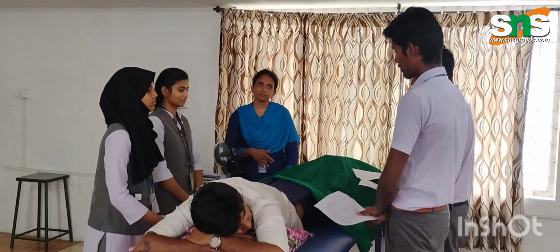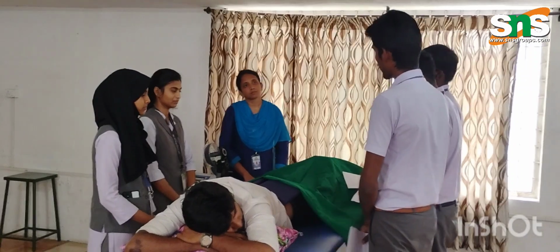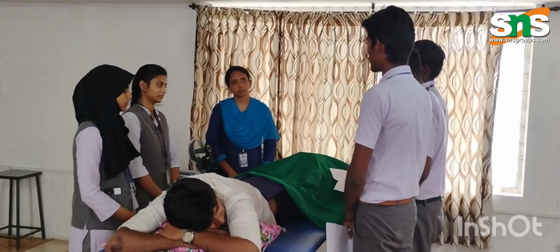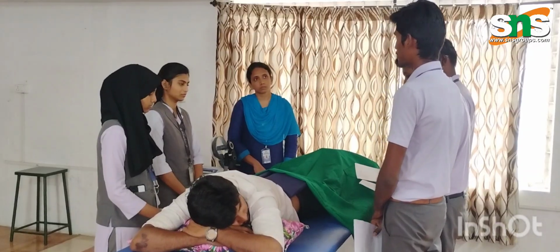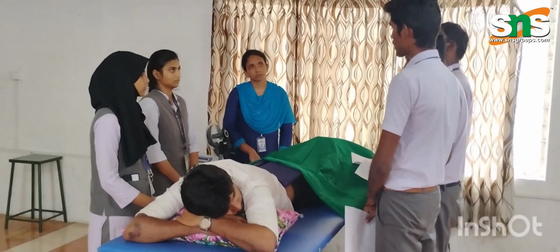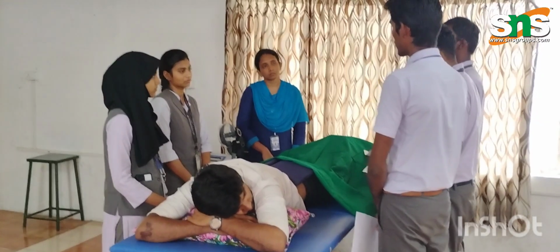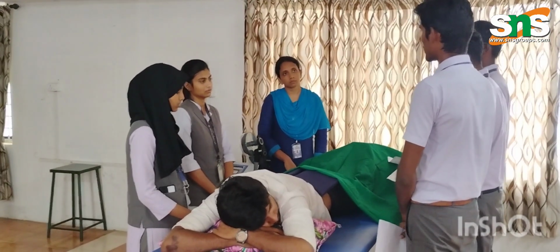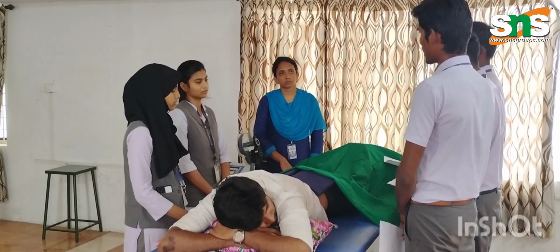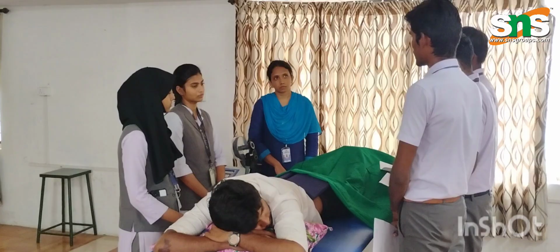Next is the mechanism of short wave diathermy. We can commonly use it for chronic pain of more than 3 months, and commonly for muscle. The mechanism is producing electromagnetic agitation, heat energy. Physiologically it improves blood flow by vasodilation, improves the metabolic rate, and reduces exudates. So it promotes heat.